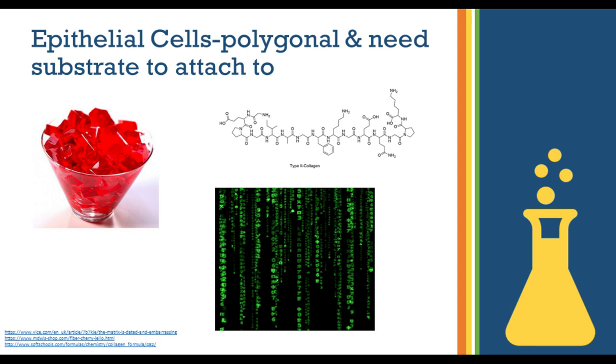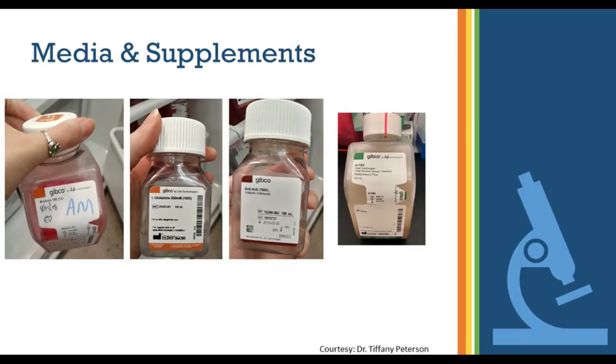You also have collagen. So here's a picture of collagen matrix. And then here's a picture of the actual matrix to symbolize Matrigel, which is the more extreme, really nice substrate with which to grow cell culture. So since our lab already does a lot of cell culture work, we grow both brain microvascular endothelial cells and astrocytes. We kind of had an idea of what media we're going to need to grow brain cells. And after a lot of playing around with different types of media, like DMEM and M199, we settled on M199.